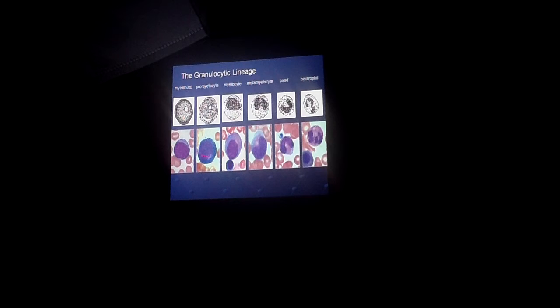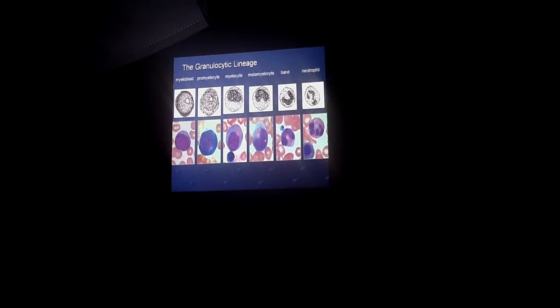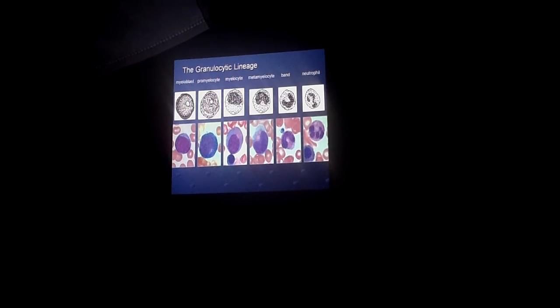And then, comparing the color of the chromatin content of the nucleus as to the other cells in the lineage, that cell will have a more or less clean appearance of its nucleus. Dito may mga granules na, or granulated ng appearance ng chromatin.